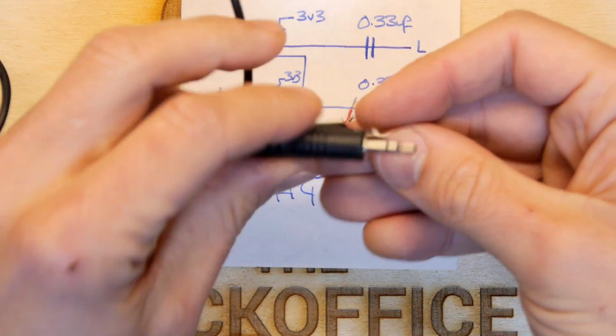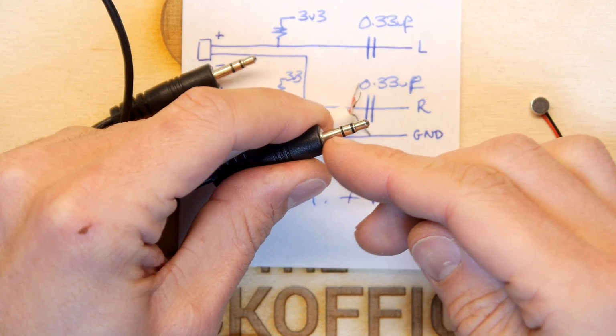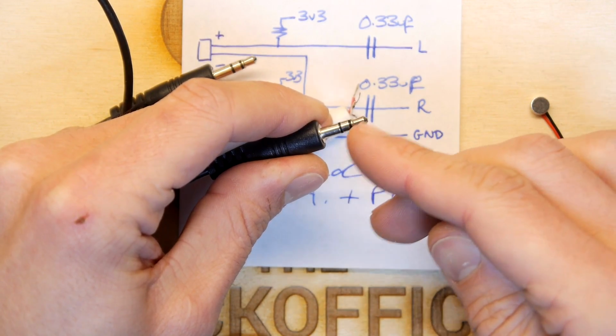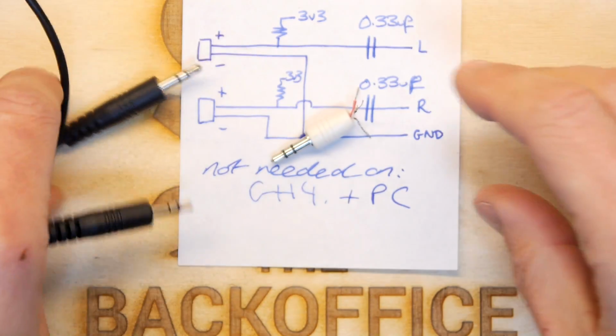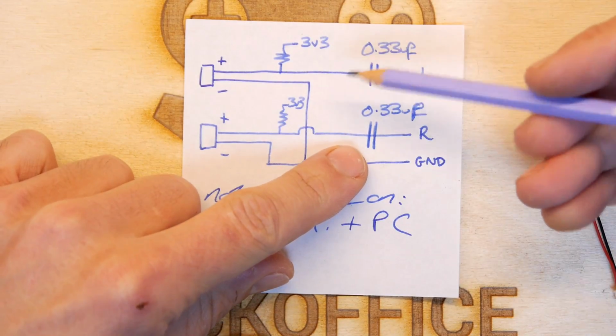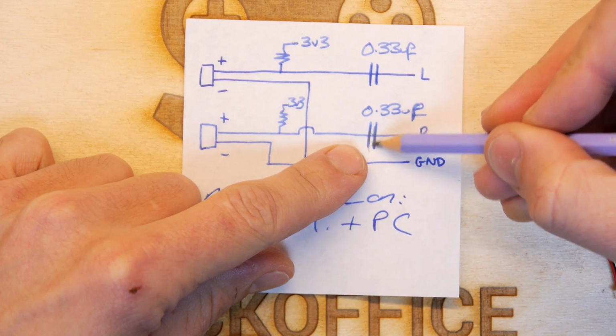Similarly, if you're using these, test between this big bottom one and either of these two. In fact, each of them should show a voltage if there is phantom power there. And if you've got that, then great. Otherwise, you're gonna have to build a little circuit like this where you've got a decoupling capacitor. I didn't draw it right at the beginning. That's why there's a little line there.